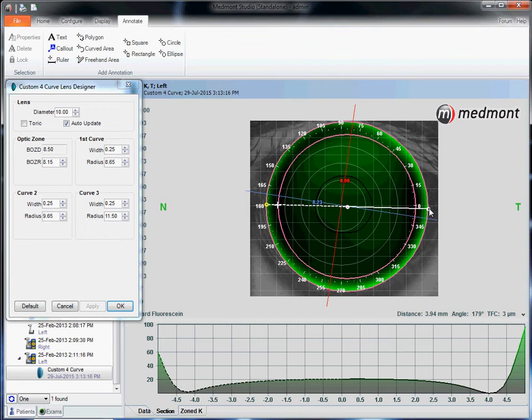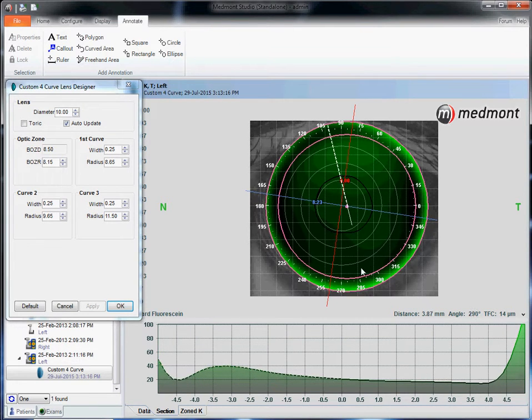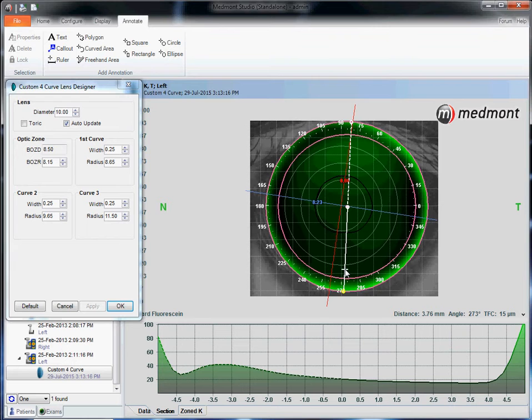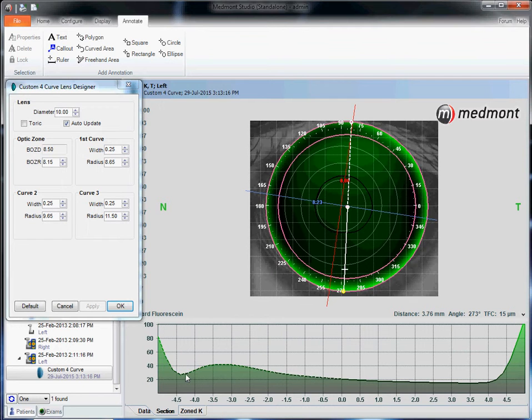Let's find out how much fluid exists under the steepest meridian of the eye where the fluid layer would be the thickest. We see heading north across this dotted section of the line here corresponding with the dotted here, we have 20 microns in the center but a slight increase as we move north.